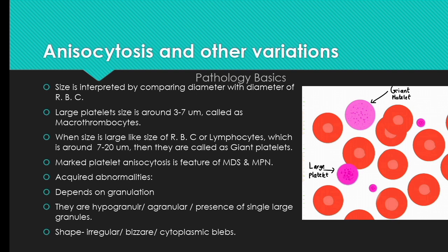And when the size is large, like the size of an RBC — around 7 to 20 microns — then they are called giant platelets. Marked platelet anisocytosis is a feature of myelodysplastic syndrome and myeloproliferative neoplasm.